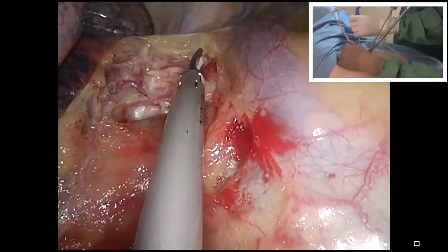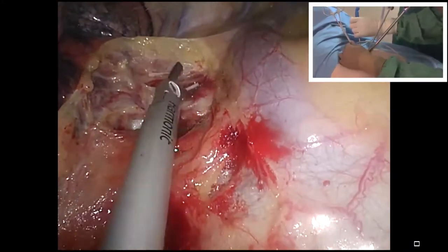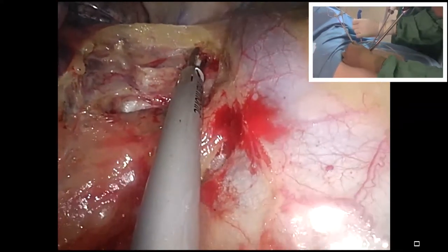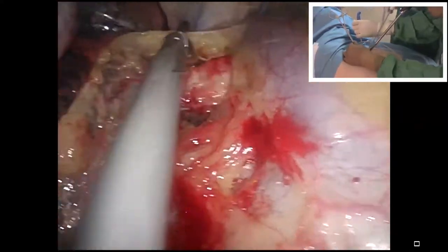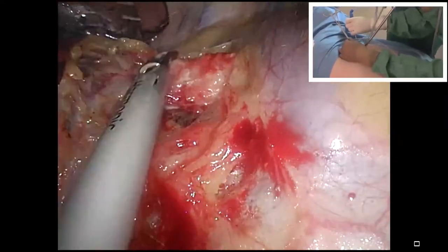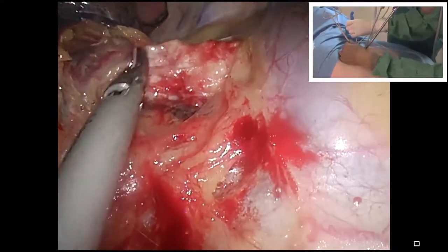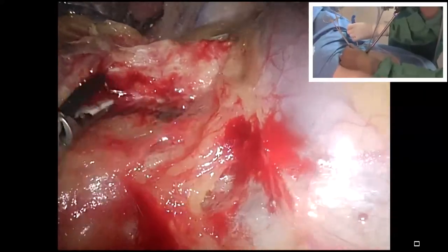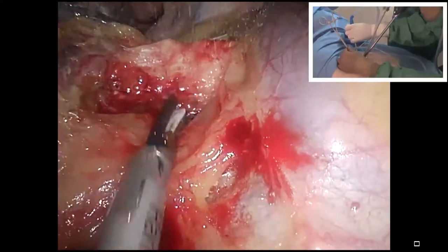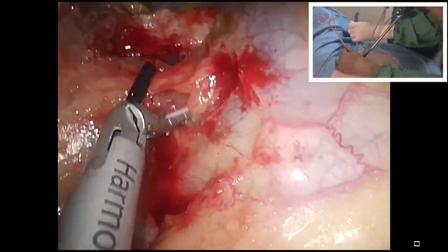Mahmoud? Bronchial artery now. So yeah. I see some lymph nodes below the main right. Yeah. And we try now to isolate the posterior hilum. Robert Cerfolio would be happy if you go for the posterior aspect. He always requires to have the posterior aspect.